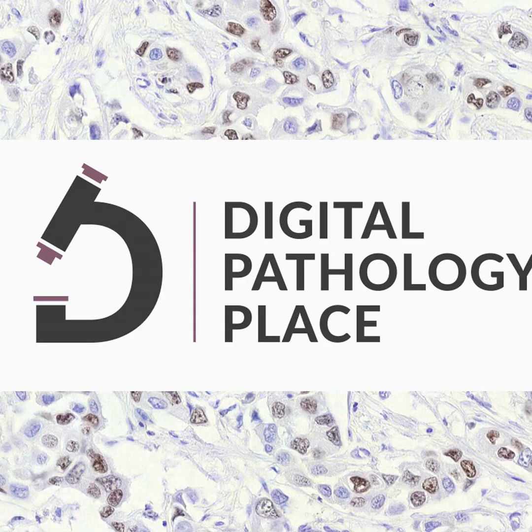But you also want to think a step further, which is how are you going to evaluate this on maybe an external cohort of data, maybe images from a different scanner, different patient populations. If those are things that your model will encounter once it's deployed, you need to be validating on those. And so you need to be thinking ahead about how to collect that data, how to annotate it, and have it ready for when you need it, because you don't want to be doing that at the last minute. And you want to be able to understand whether your model can accommodate the potential domain shifts, which hopefully after understanding your data, you know what they are, and you want to validate against those.